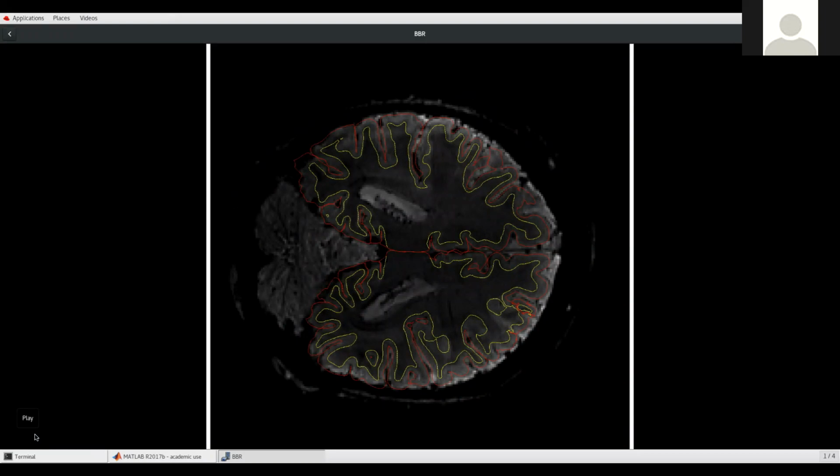In principle, and this is why I was harping so badly on the T1 weighted EPI. If our EPI were so good that we could segment them, and it's not true, then we could have the segmented gray matter in the EPI and the segmented gray matter in the anatomy. And we would know we had done it right when those were exactly on top of each other. Perfect segmentation of the EPI, perfect segmentation of the anatomy. Yeah. And then surface node by surface node, you could compute: here my gray matter is 100% overlapping, here it is 50% overlapping. It would be a spatially heterogeneous metric, but an absolute quantifiable metric that you could optimize at each location. Is my gray matter perfectly aligned?